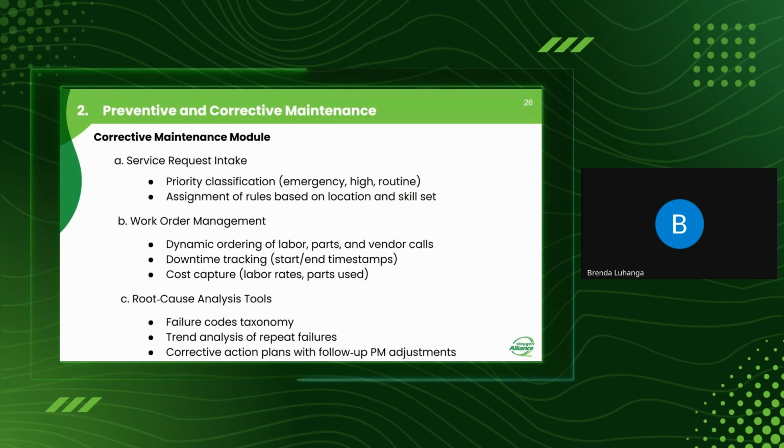Then you can also assign these maintenance tasks to technicians based on their skill sets, but also the location and capability of your health facility to handle the maintenance. Then secondly, you deal with the work order management.